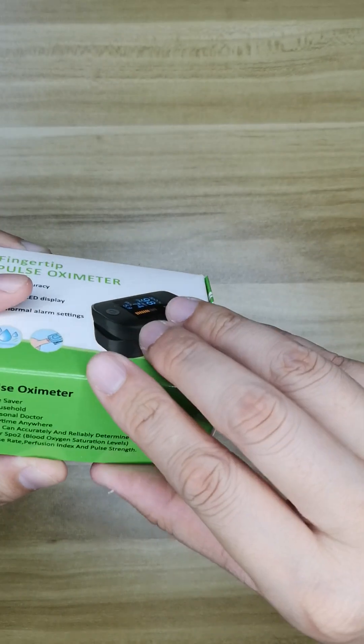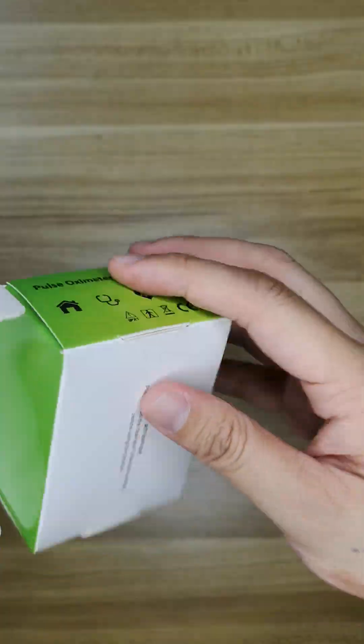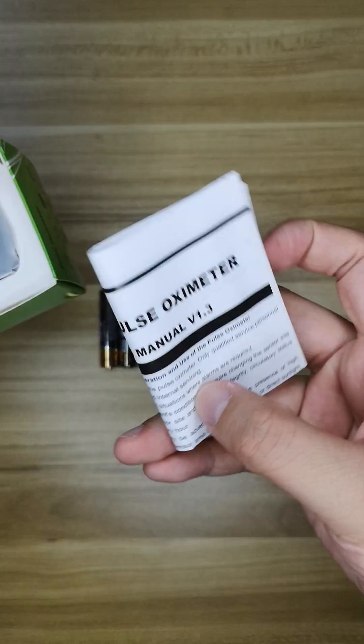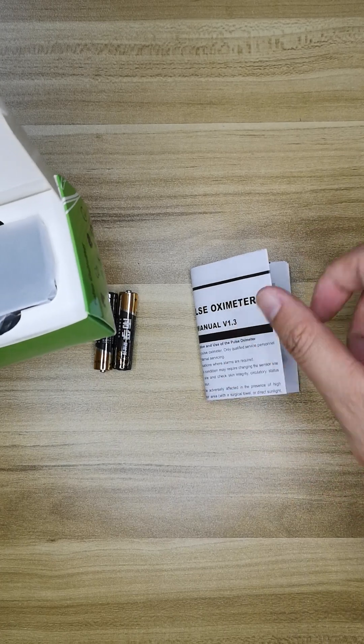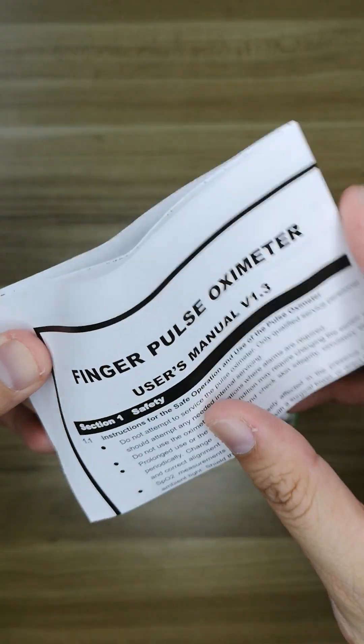Okay, now let's open it. Here we have one manual. This is the battery, and it's not included in this product.